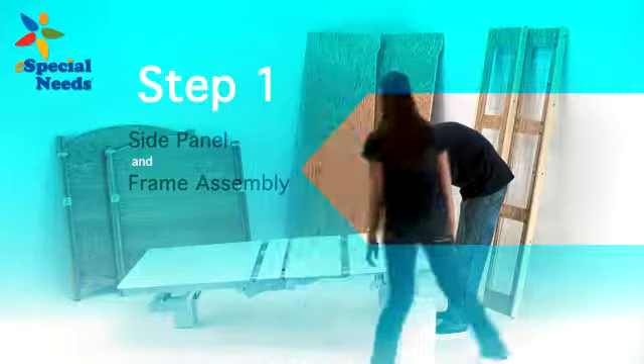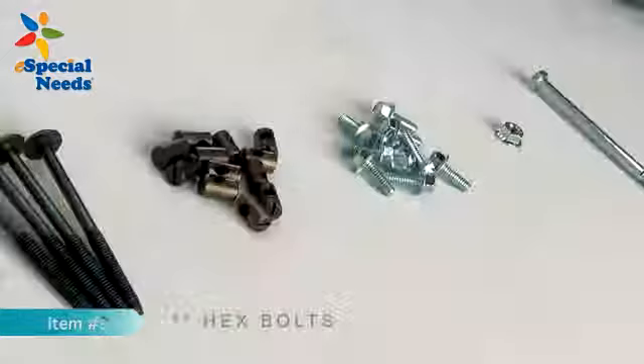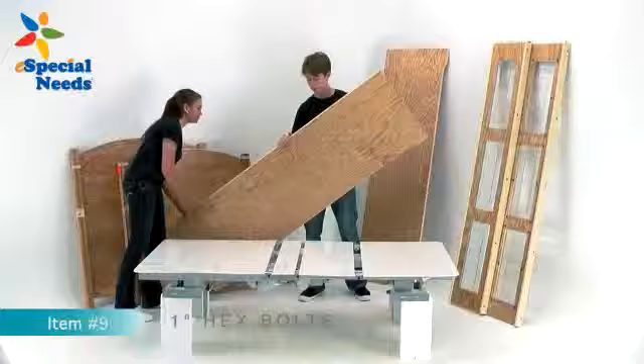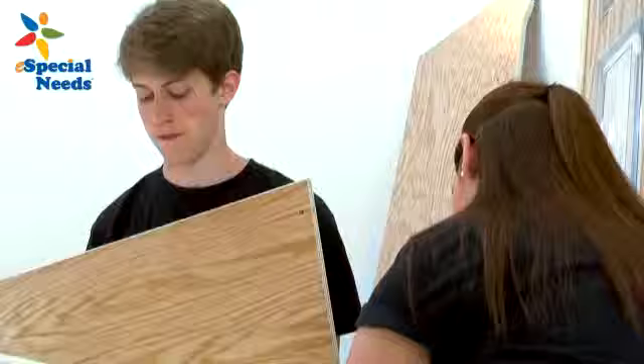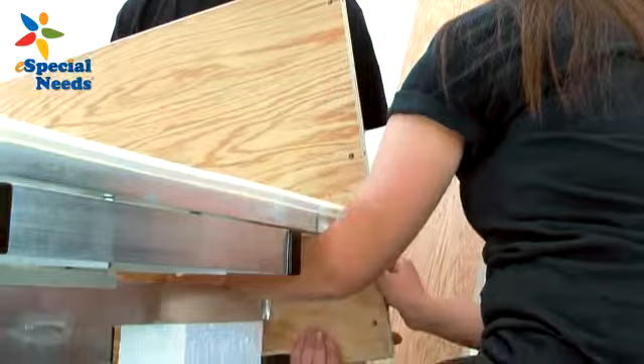Step 1. Set the electric frame upright with foam spacer blocks underneath each corner of the mounting brackets as shown. Using the 8 silver hex bolts, attach the side panels, item number 4, to the brackets on the frame, but do not tighten the bolts completely. This allows freedom of movement for alignment purposes in the next step.